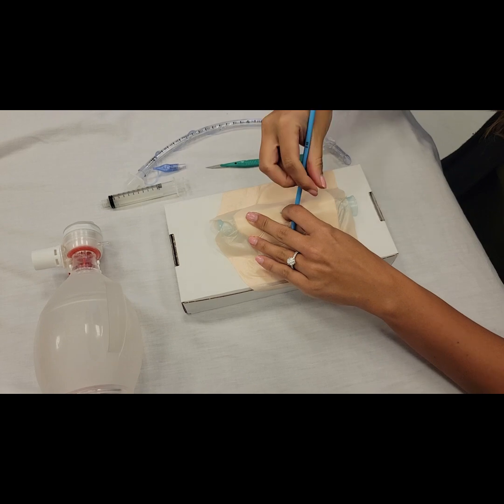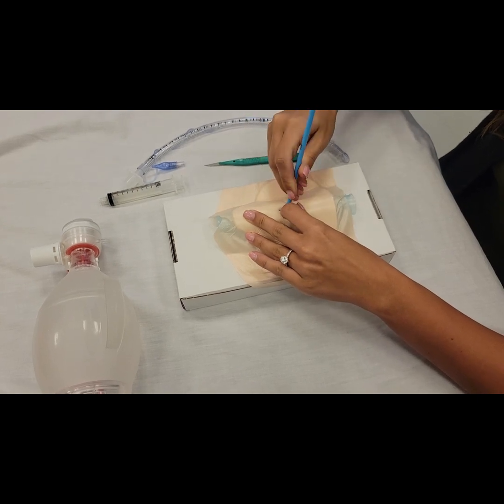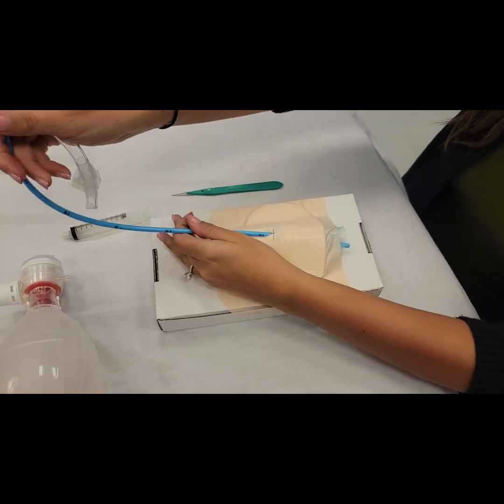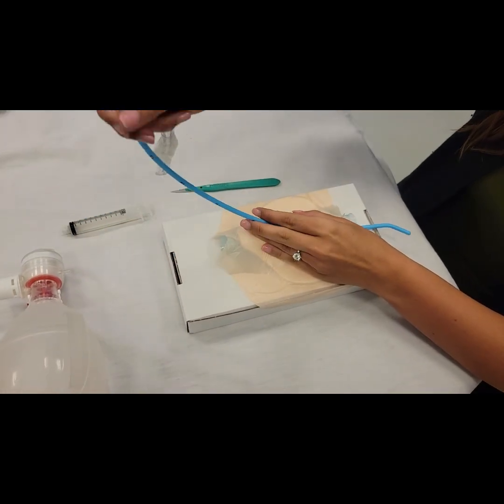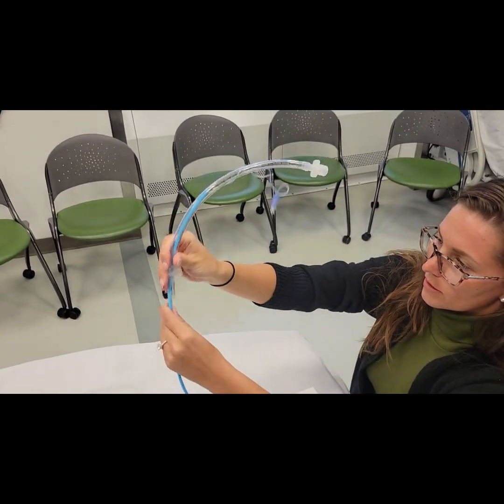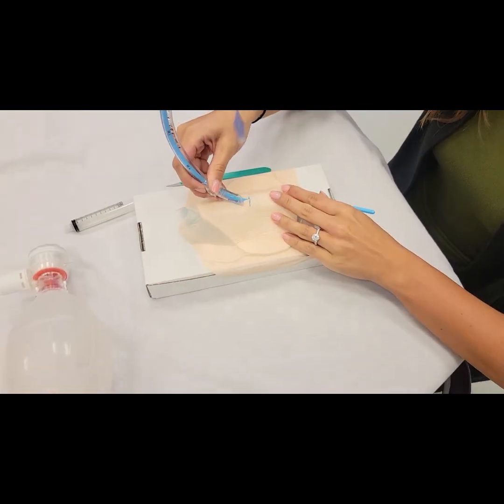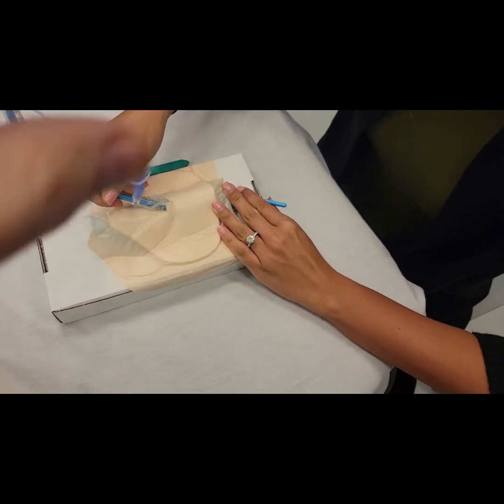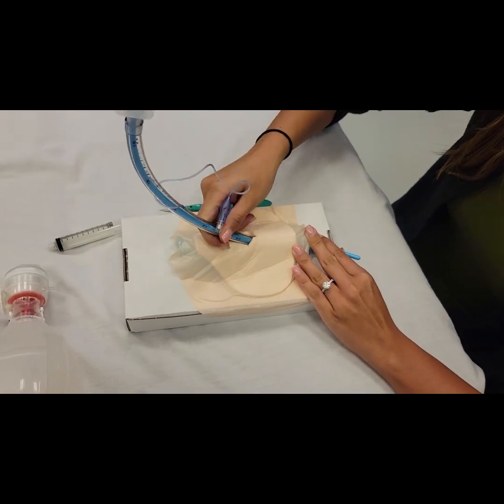Pass the bougie, and then thread your ET tube over this, and hopefully your incision is big enough to pass the bougie and the ET tube at the same time.